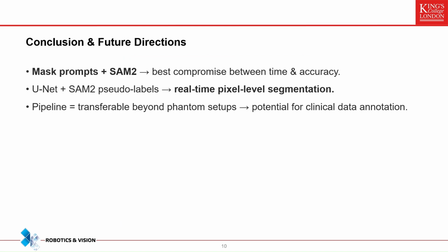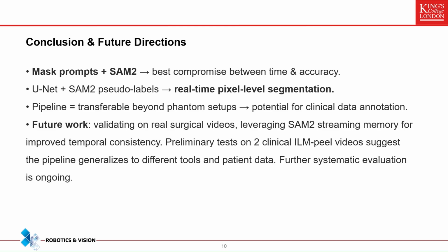This study shows that foundation models like SAM2 can be integrated into annotation pipelines to efficiently generate training data for lightweight segmentation networks. These networks achieve real-time inference and address a critical clinical requirement in retinal microsurgery, where high-speed pixel-level feedback is necessary for surgical safety and precision. Ongoing work focuses on extending the pipeline to clinical videos featuring varied tools and conditions.